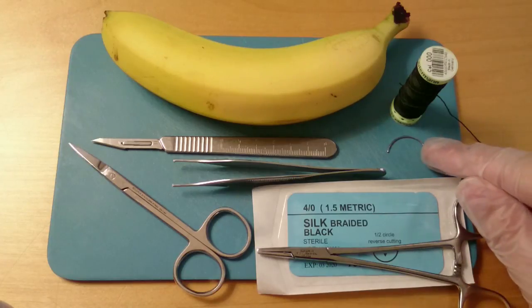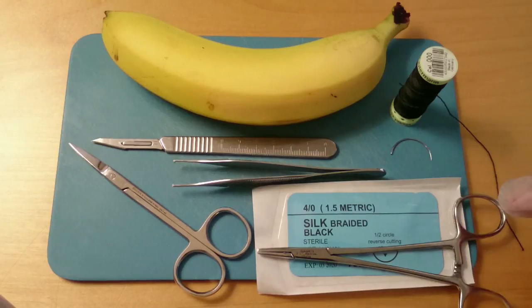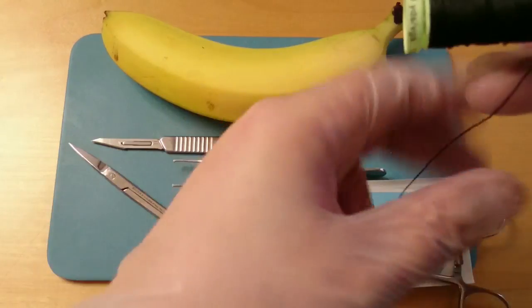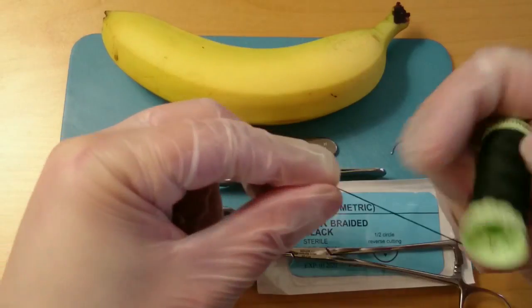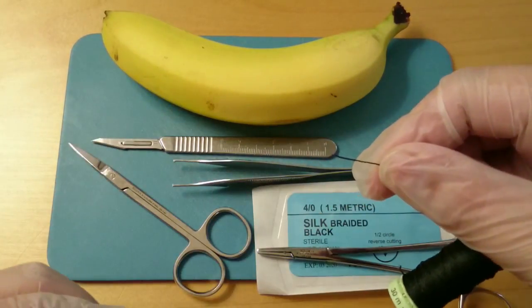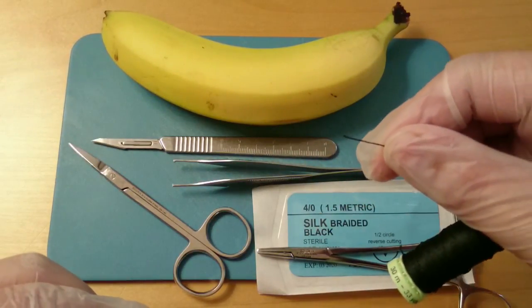Alternatively, you can use a bent needle which is used for upholstery and a little bit thicker. I recommend when training, a little bit thicker polyester thread.